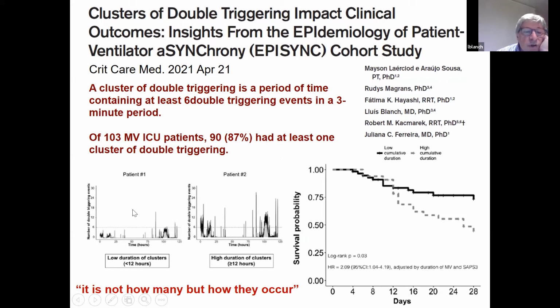Here are two patients, one with low and one with high duration, and the survival probability was higher in patients with less than 12 hours with clusters. And this is very interesting.